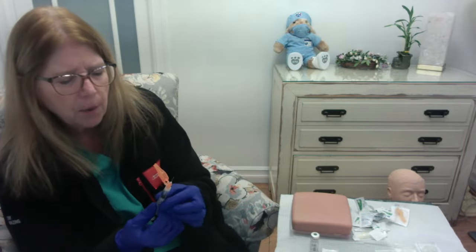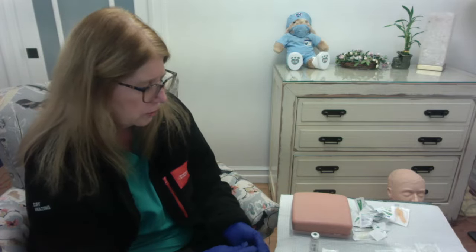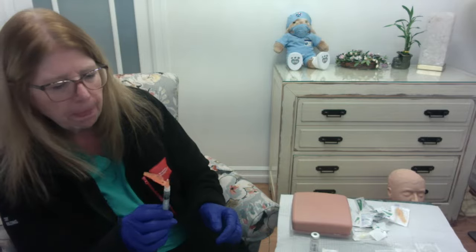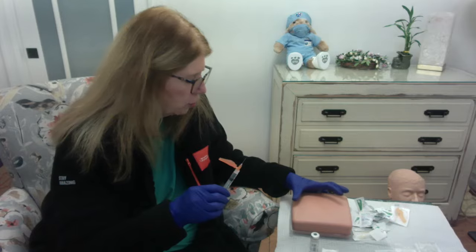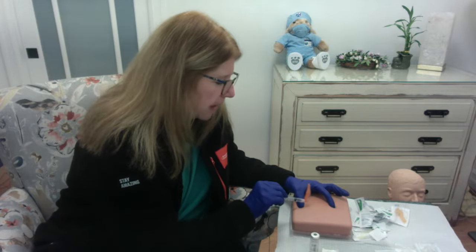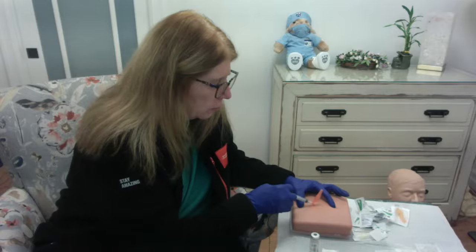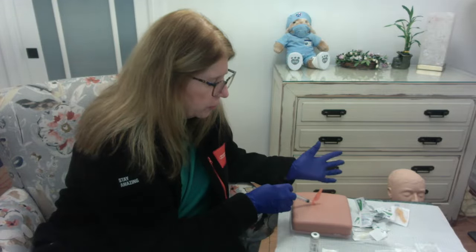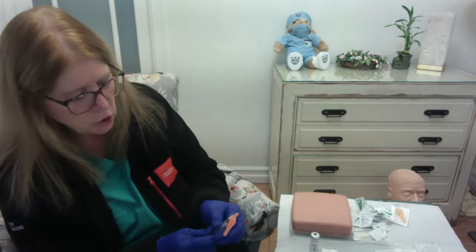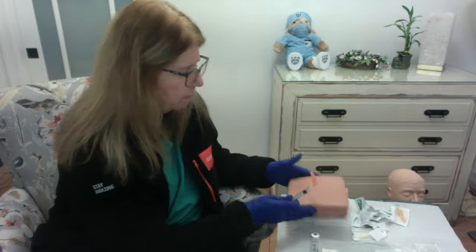It's facing me, okay? And I am going to just let that alcohol dry for a moment, all right? And bevel up. Okay, alcohol is dry. I'm going to do a pinch here, and I'm going to go in at that 45-degree angle. I'm going to inject, release the skin, pull out the needle. Okay, so let me just show you that a little bit more up close in the camera.